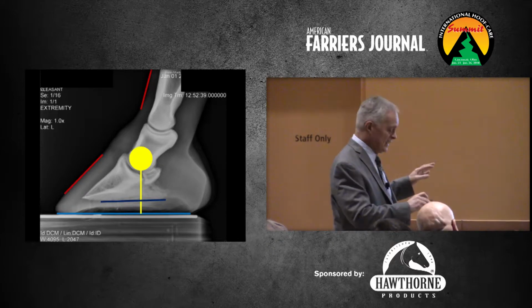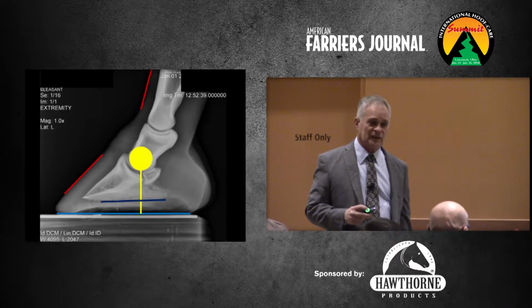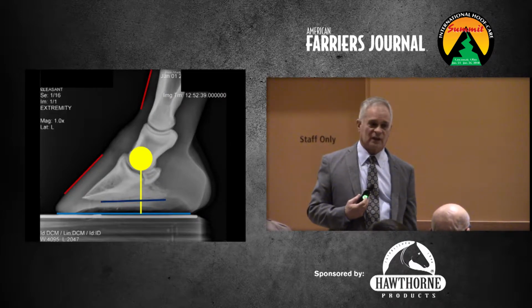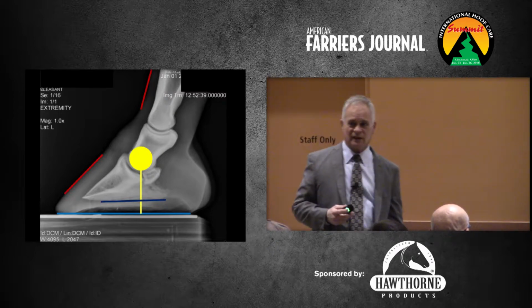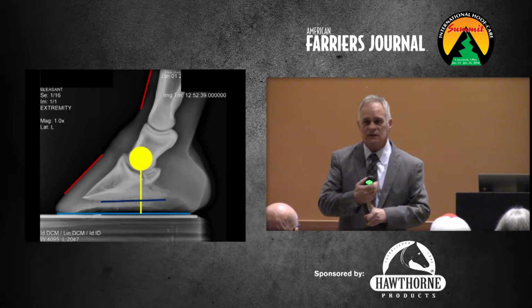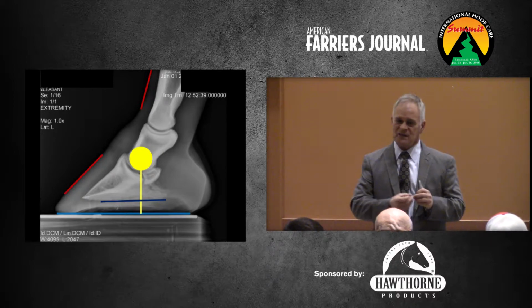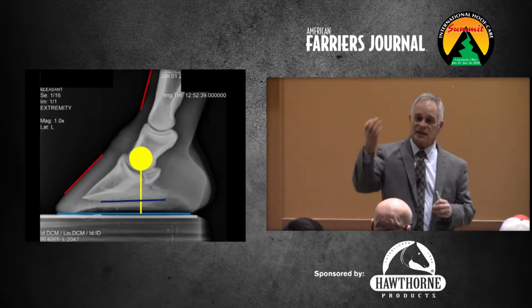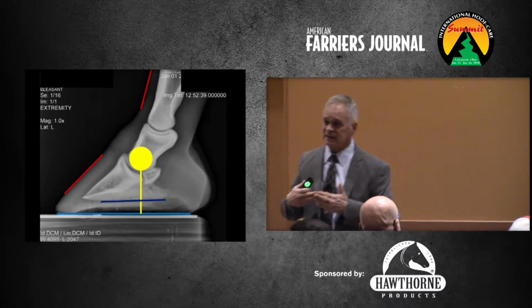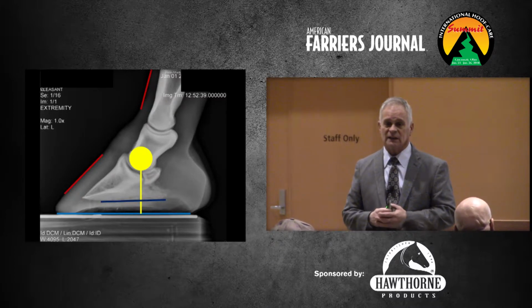All right. So again, what you had was this to start with, and you've got to say, what can I do to help this horse? So you guys want to comment? David, you can, or we'll take audience. Okay, so here's some wedges. So increases palmar angle. Purpose of that is to relieve some of that tension on the deep digital flexor tendon. It'll improve his hoof pastern axis. Okay, so moving the breakover back.